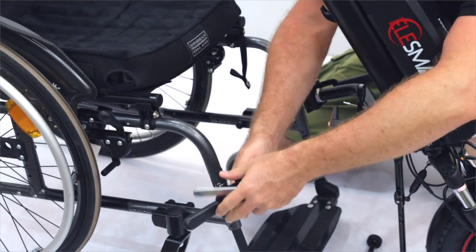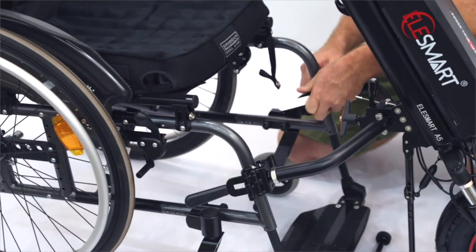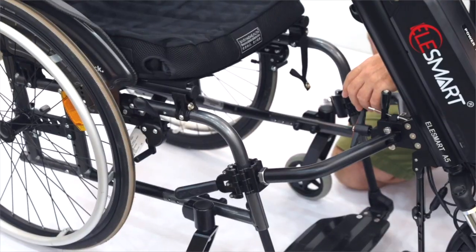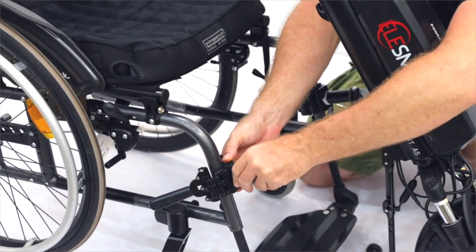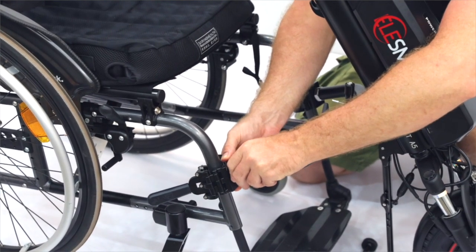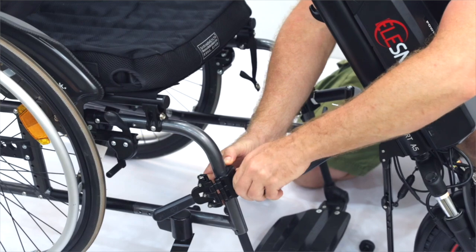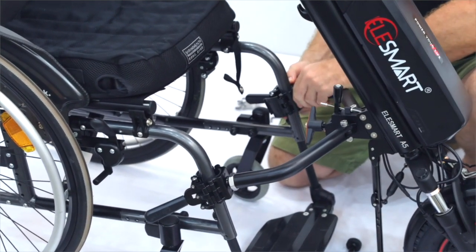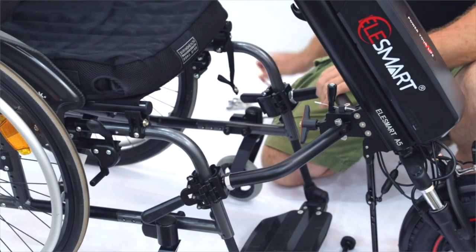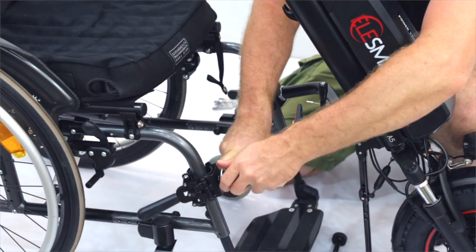So we undo the clamps, bring the wheelchair in close. The next adjustments we need to make are the angle of the clamp to fit the angle of the wheelchair. Turn it so that it fits tightly, then tighten down the clamp, then tighten down the bolt. Same on this side. And then take our wrench and make it snug.